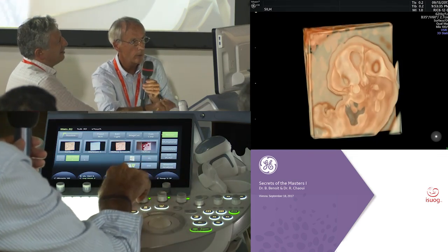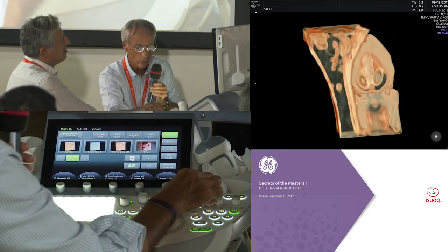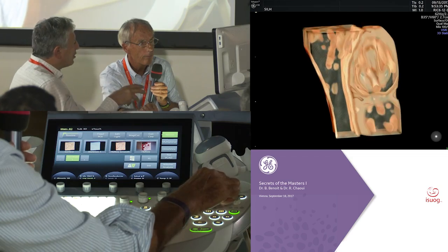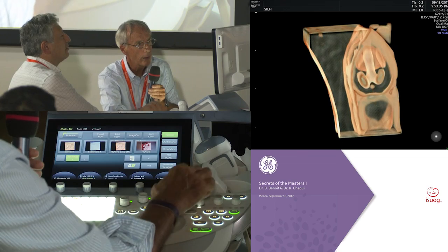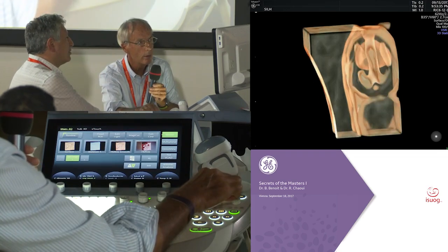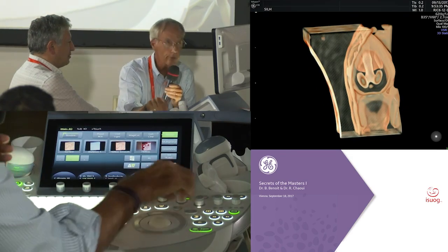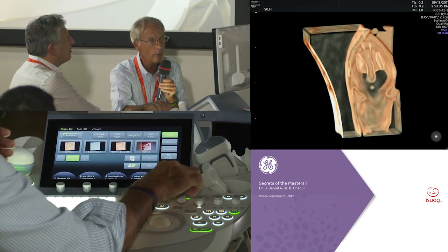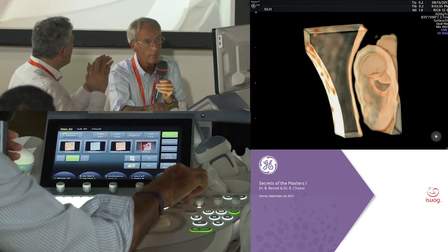And again, we can turn. And you play with the gain, yes, play with the gain, always. Oh, this is good. And now I scroll inside. Oh, wow. This is a zoom, and this is a scrolling button here. And you go to the diencephalon and the posterior. They are not transparent anymore, but you see.